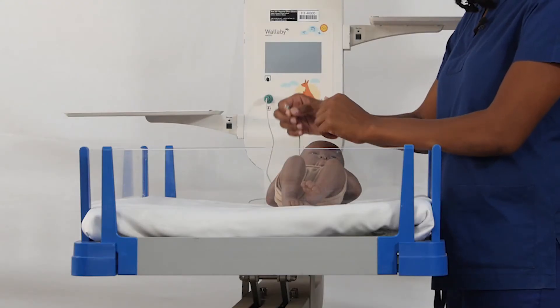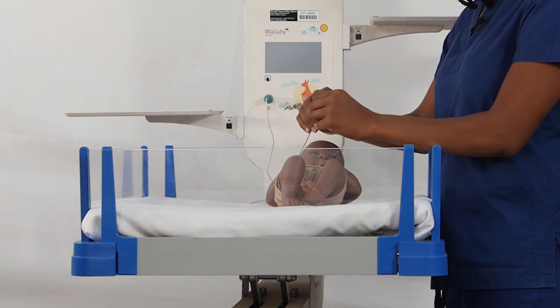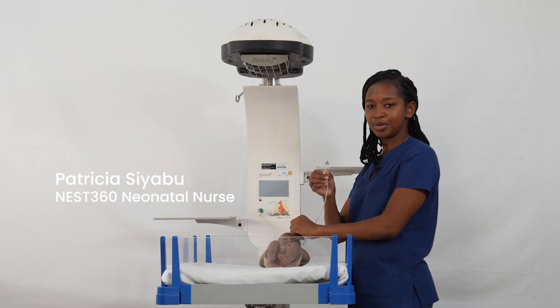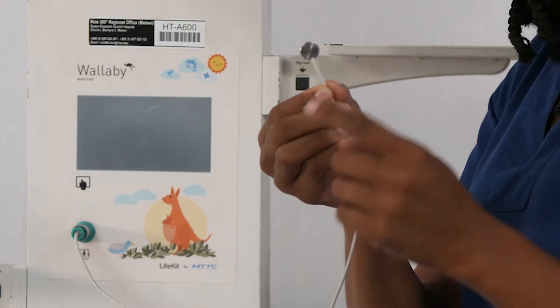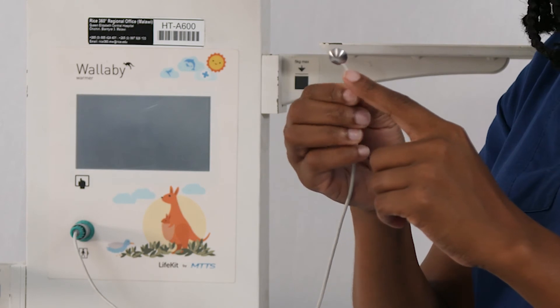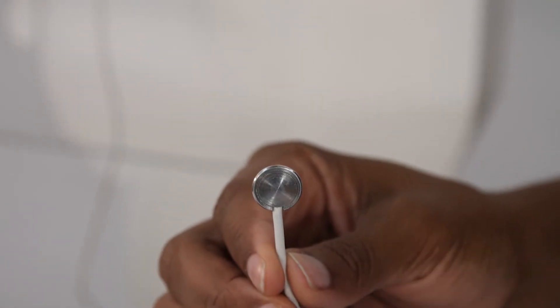Place the baby in the middle of the cot. For the machine to read the baby's temperature, you need to attach the probe. This is the thermometer probe. It has two sides — the first side is flat and the other one is curved.